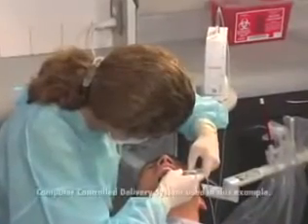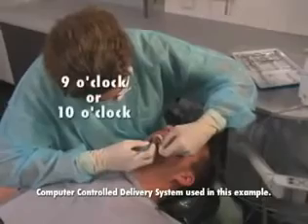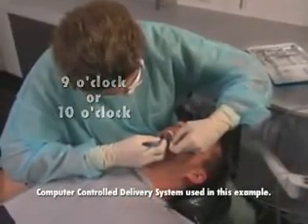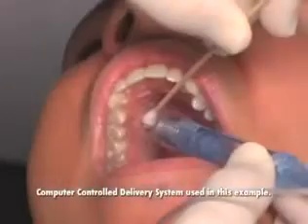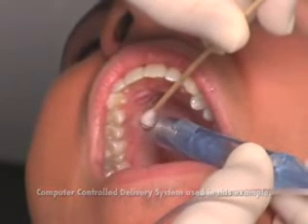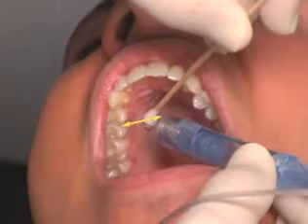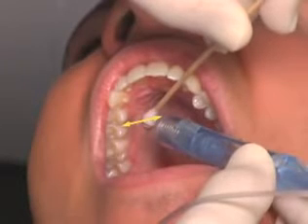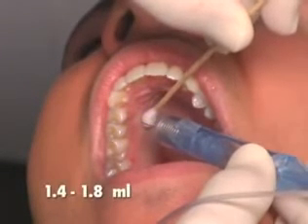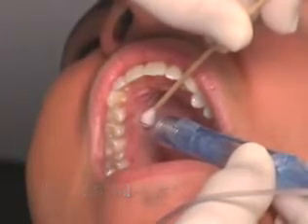For the AMSA nerve block, sit at the 9 or 10 o'clock position facing in the same direction as the patient. The needle is inserted into the tissues at a point halfway along the line between the premolars and the midline of the palate. 1.4 to 1.8 mls of anesthetic is slowly deposited.